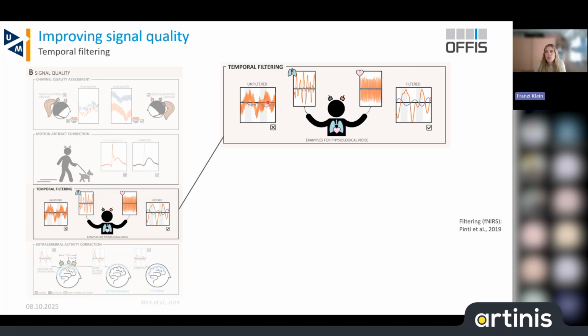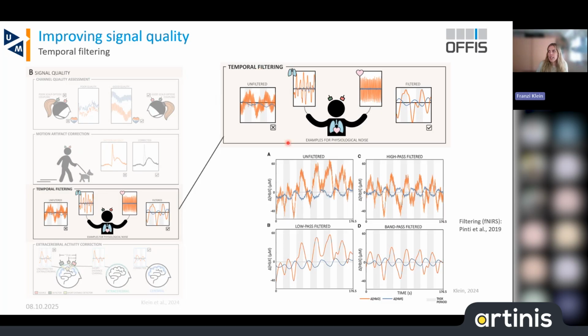And in addition, there are also some algorithms available for which it's not too relevant to remove too much from the signal. So they are quite stable and can handle such artifacts. So again, it's always a bit dependent on what you want to do with your signal, how you want to generate your feedback. And then you can typically use, from the type of filter, it's very similar again, right? If we compare with our unfiltered signal, we see that in this case, it is always a very good idea to apply some sort of filter.